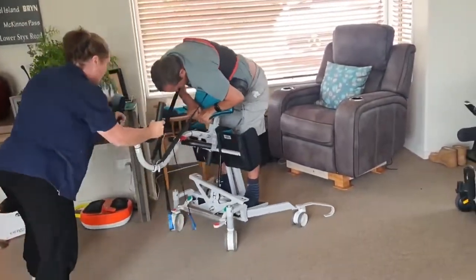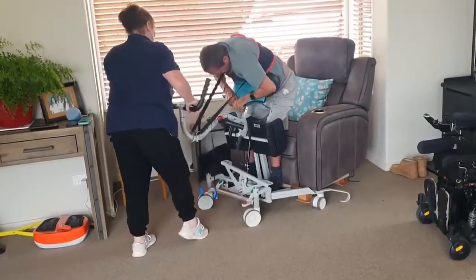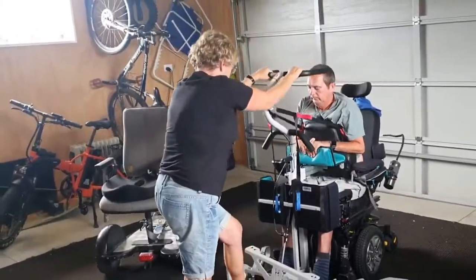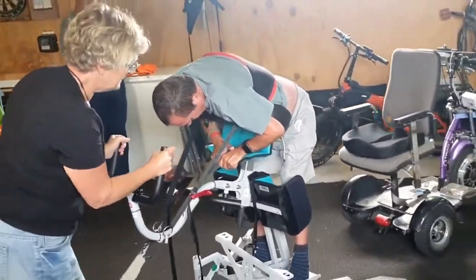Compared to the other option, which is what's called the sling hoist, I'm really pleased to have the Carer to use every day. I use it three or four times a day, in and out, and we only need one person to help me transfer into my trike, which is a necessity for me to get out and about on my own. It's easy, quick, and I'm out in very limited time.